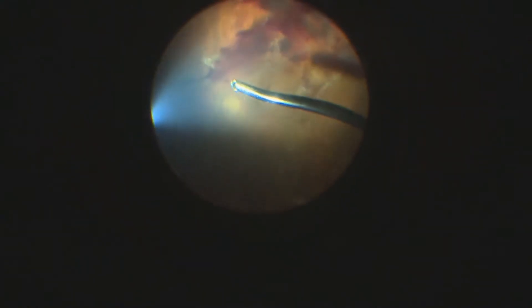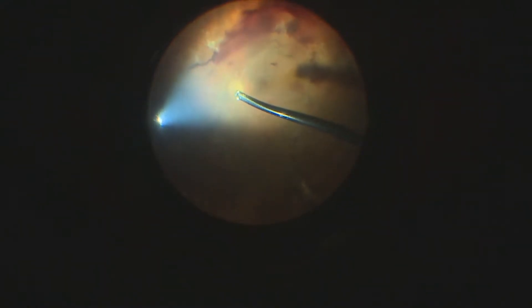First, we will start by removing the posterior hyaloid and its epicenters connected to the fibro-vascular tissue, trying not to harm the retina — avoiding ruptures.